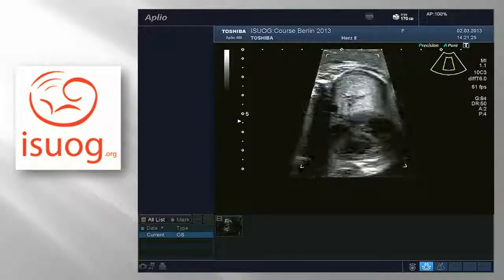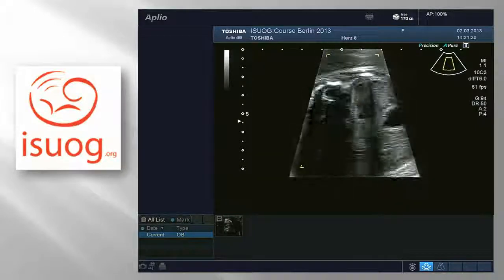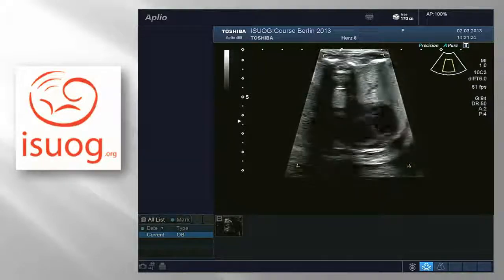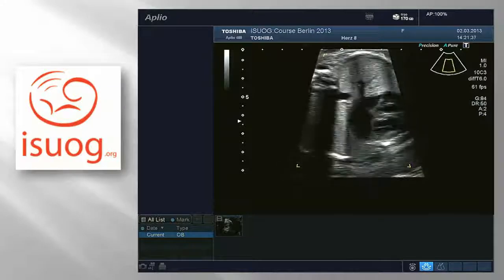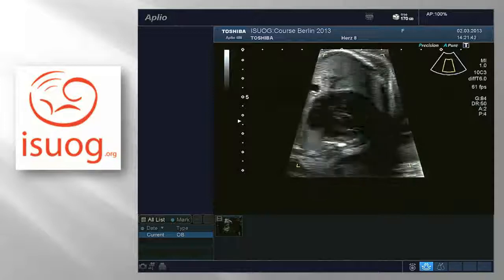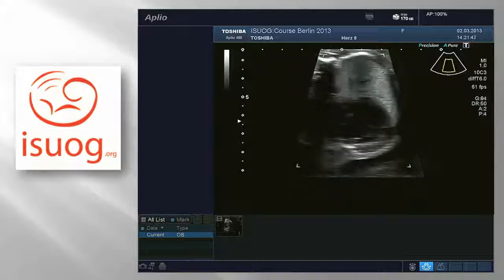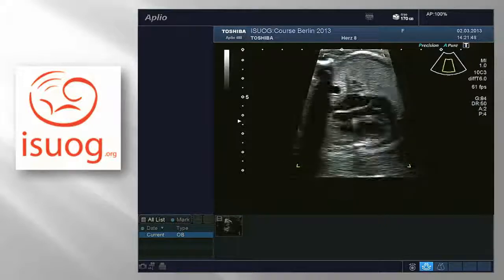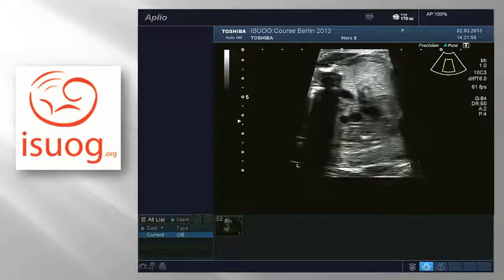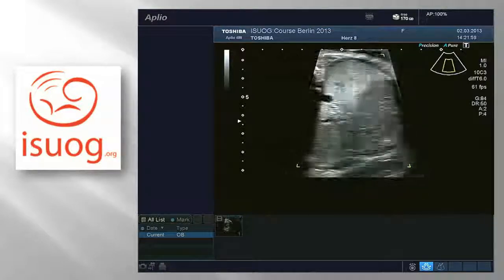So coming back here, I'm not quite sure how much more time. In a baby that you start scanning, you say, oh no, spine on the top. Really, don't be put off by that. We've seen everything. If you're here, it's more difficult, but just go to the side a little bit, and you can see all the structures. Just minor adjustments here that I'm making just to see separate things: the 4-chamber, outflow tracts, 3-vessel trachea view. Everything there. Beautiful baby. Great.